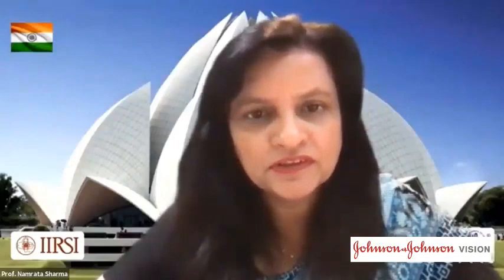Vish, there's a question for you. They're asking, can this prosthesis be used for albinism? Sure, I don't see why not. Again, you've got to be careful with the capsule integrity when you're doing that, but sure. And this is something you would not put passively in the sulcus in a phakic patient. You definitely need to remove the lens when you're doing this. And why would you want to avoid Hoffman's pocket, as mentioned by Dr. Mish and Dr. IK both?